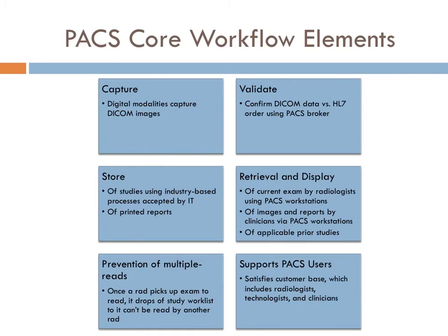Another workflow element is just storage. So the PACS stores studies using the industry standard processes generally accepted by IT. Then there is retrieval and display. So the PACS allows for the retrieval and display of current exams by radiologists via PACS diagnostic workstations, which we just talked about. Another example of retrieval and display is when a radiologist wants prior studies. So the PACS also has the function to retrieve and display prior pertinent studies.